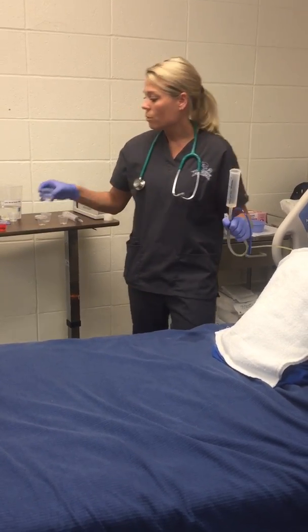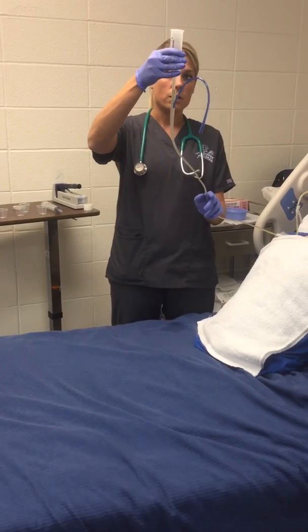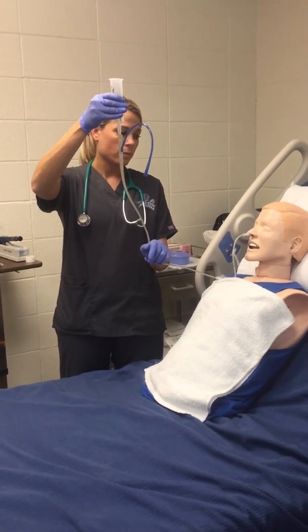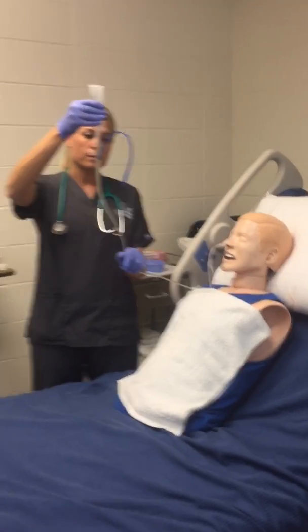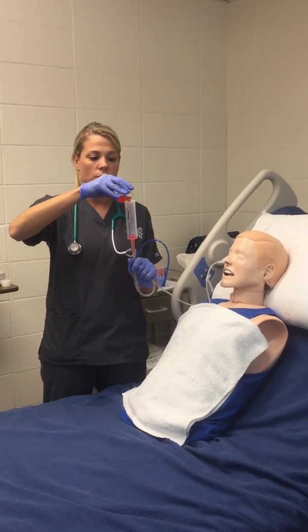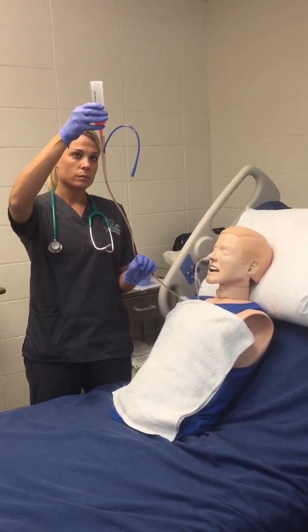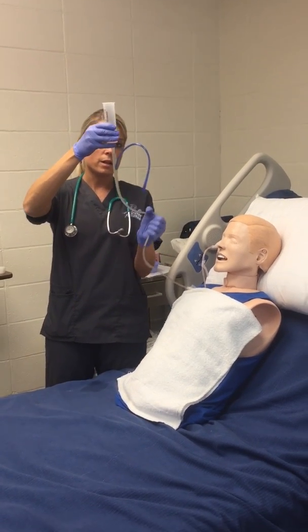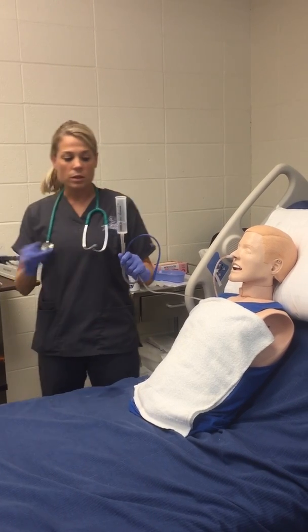So now that that medication is in, we're going to go ahead and flush again with just sterile water. And let that go on through. Okay, that flush has gone through, so now we're going to go ahead and instill the second medication. We're going to clamp off again, and we're going to flush with 20 mils of water. And then we're going to unclamp and let that go on through.